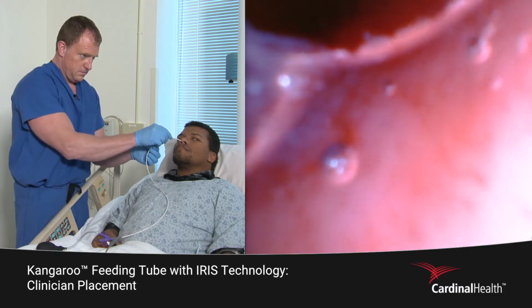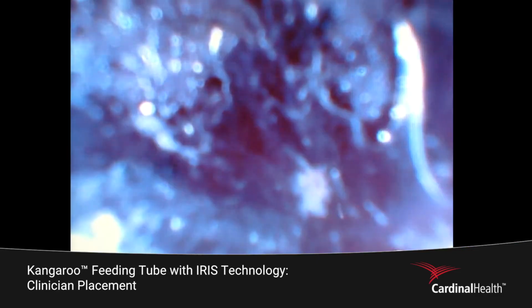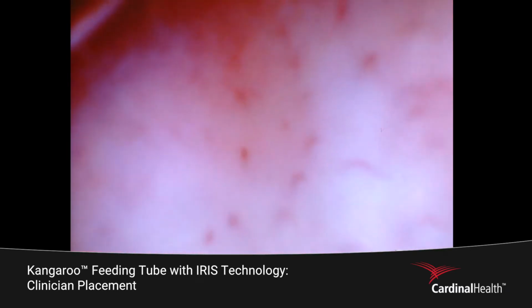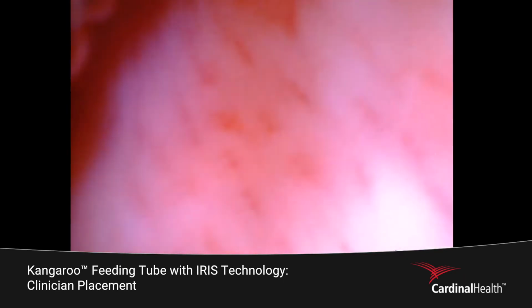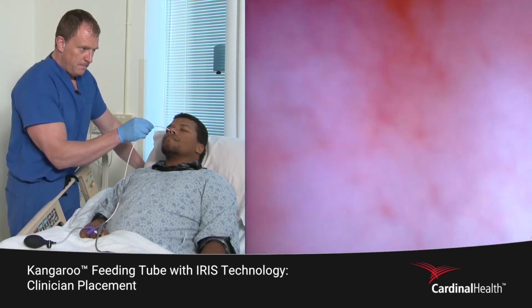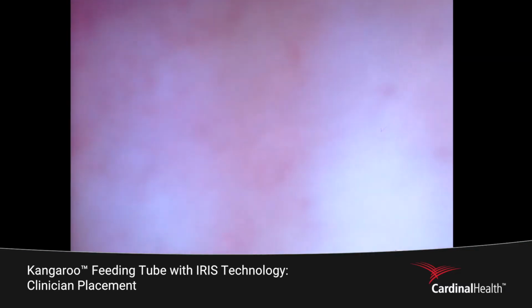Close. Walk back up a little bit. Should change my approach a little bit. And letting your stomach do a little bit of the work to move it down. Pushing towards 80.